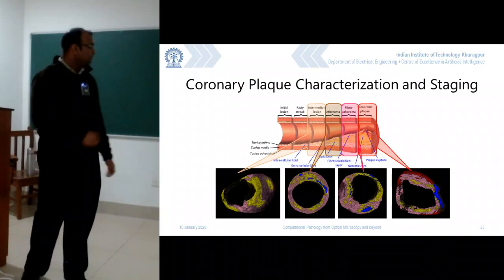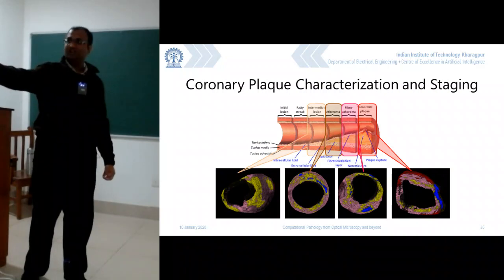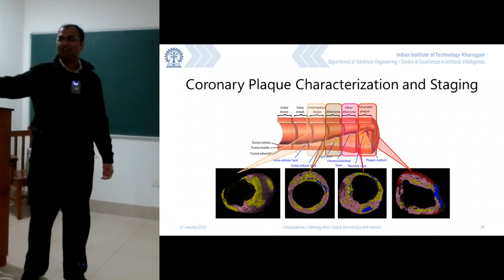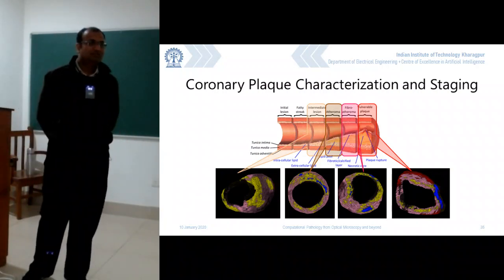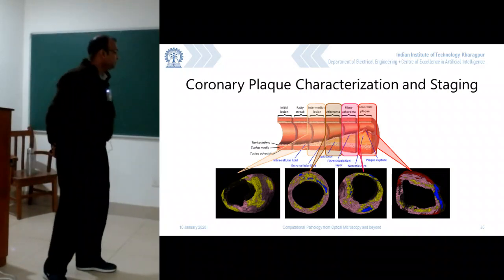So this was the proof that you can actually stage across multiple points, and in a very non-invasive way. It's not exactly non-invasive, it's minimally invasive. You have a probe to be sent inside a blood vessel, so there will still be a small pinhole kind of surgery which has to be done on your body.